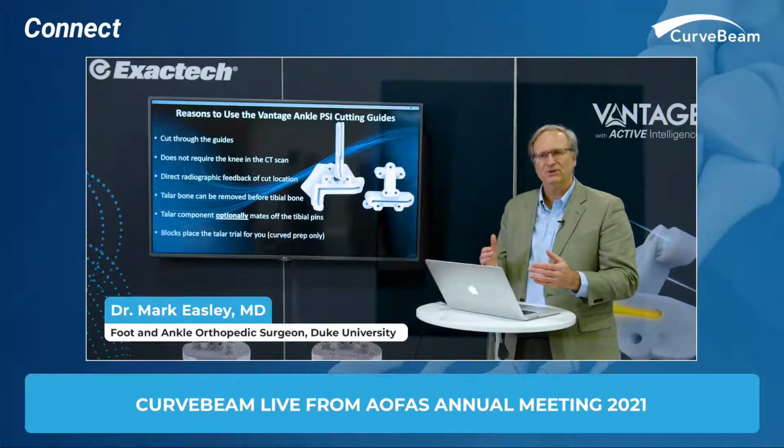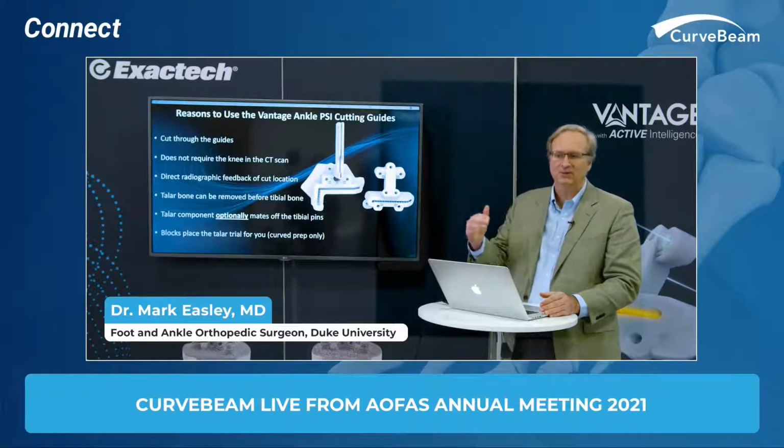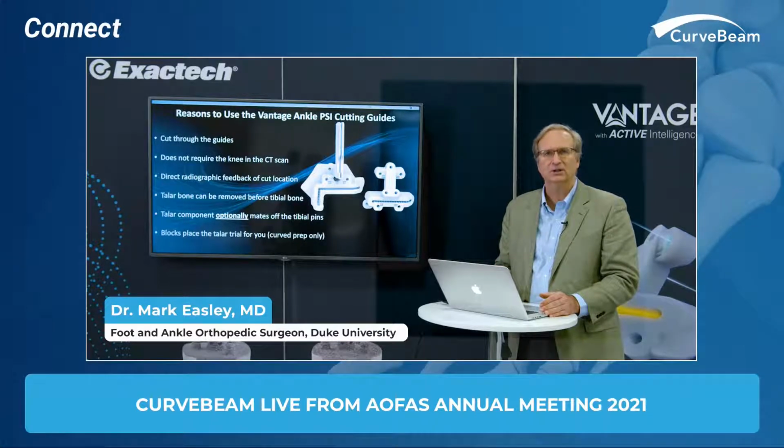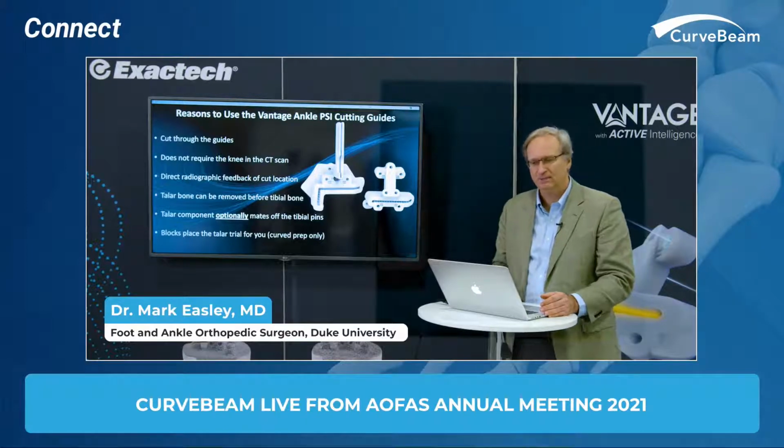And with the Vantage system, we've actually worked out a system where if you don't have the technology where the CT scan goes all the way to the knee, it can be just to the tibial level like I described, with the lower level of the PEDCAT system. And then as weight-bearing CT becomes more of the standard of care, we'll extrapolate that and be much more accurate as we move up the leg all the way to the hip.